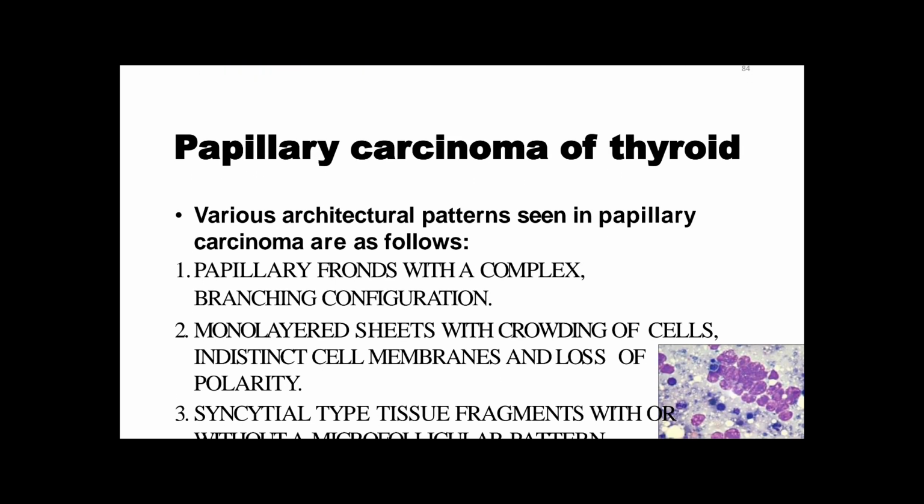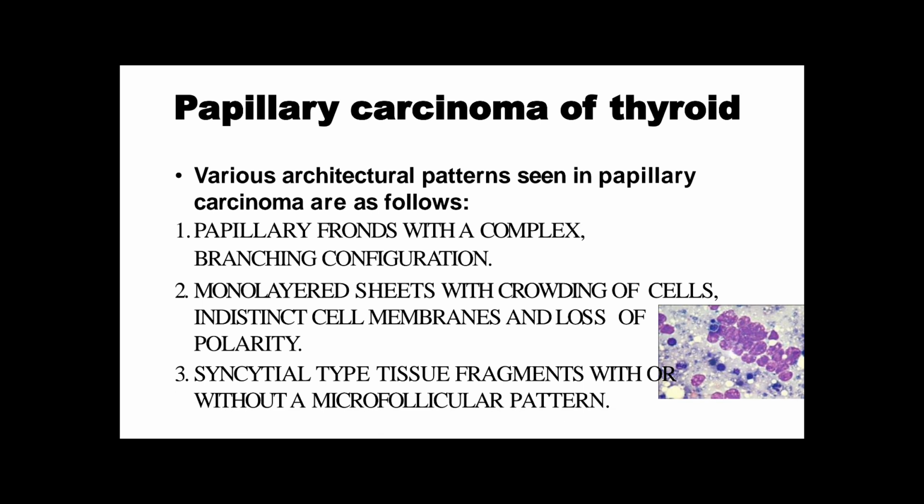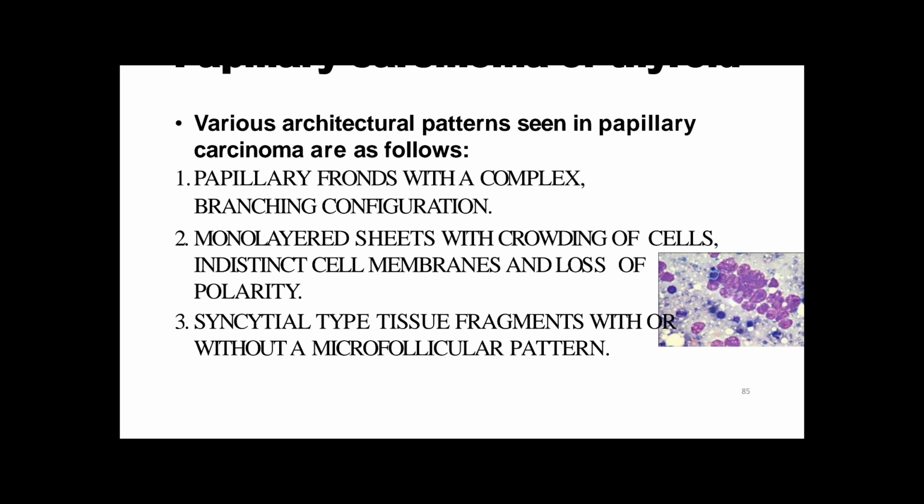Next is the papillary carcinoma of thyroid. Various architectural patterns seen in papillary carcinoma are as follows. One is papillary fronds with a complex branching configuration.